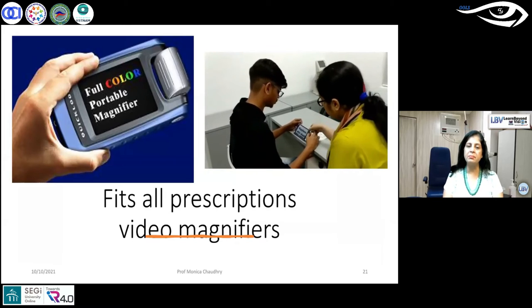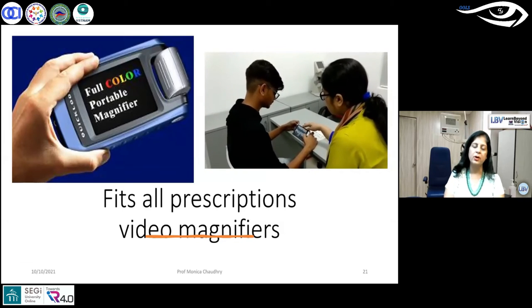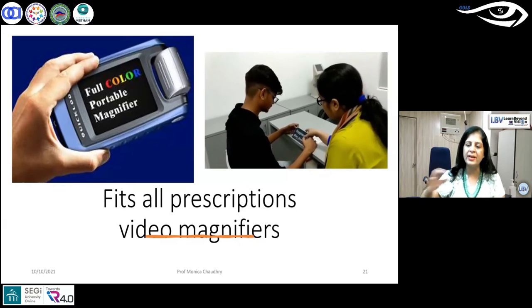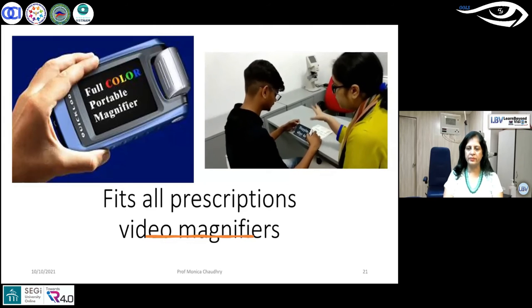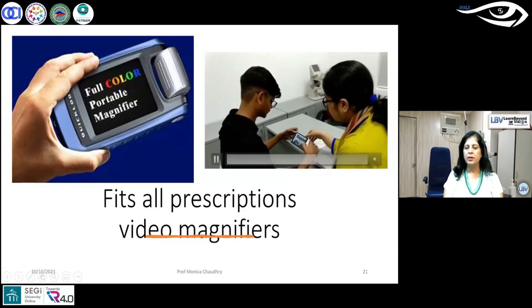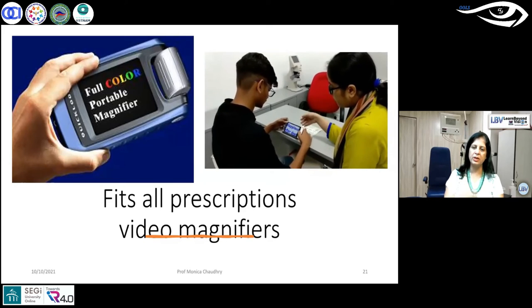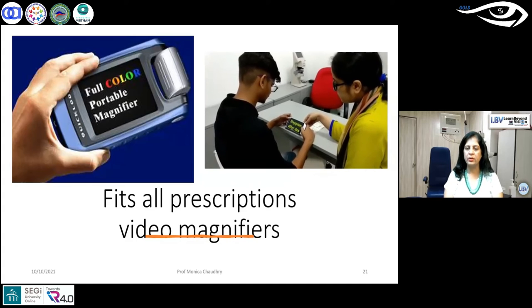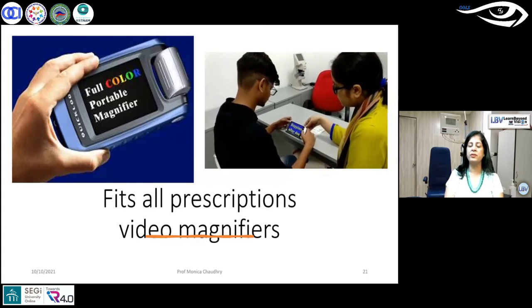Now, you would get many brands who are selling this. There are also local brands and Make in China's and other product brands. So the price varies. However, the features would vary in each one of them. So this is one of the videos of our academy when we were teaching, you know, the patients being demonstrated and trained on these kind of devices to learn and how the modes beautifully fit in.